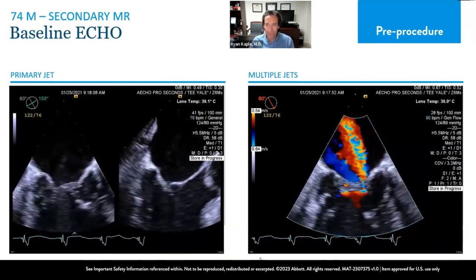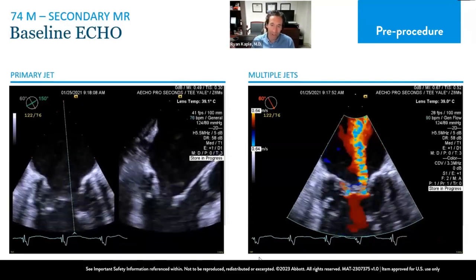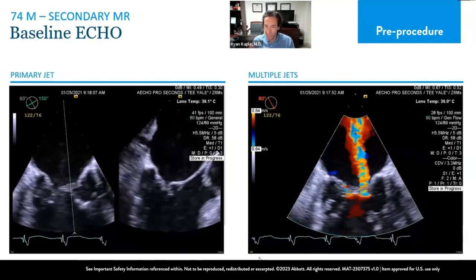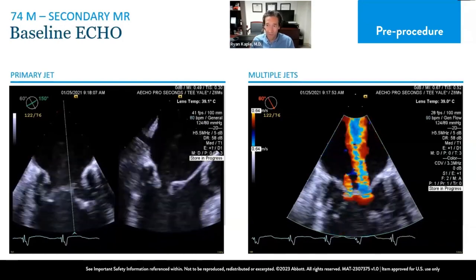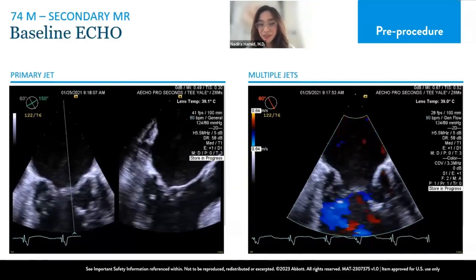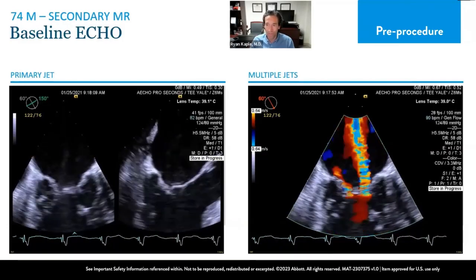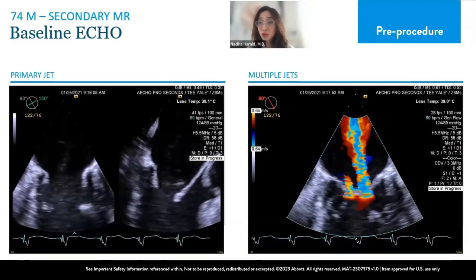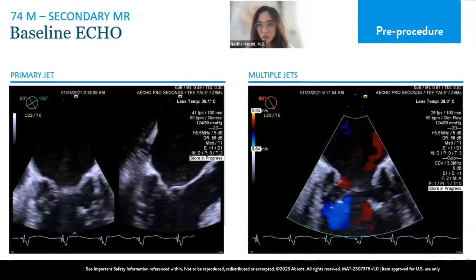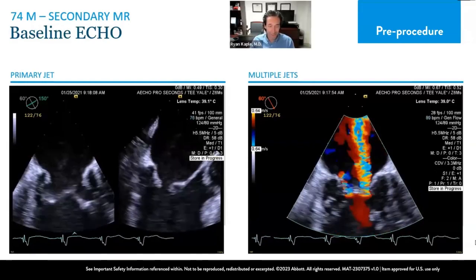But these 2 jet cases are really tough because you have to understand that potentially when you treat the more dominant jet, there's going to be an impact on that other jet, specifically if you're not lined up perfectly with the coaptation line. Is that fair to say, Nadira? Yes, and I'm actually thinking, because I had a similar case just a few weeks ago, just one right in the middle, grasp both jets and get both with one. One big one, to avoid the cords, because it's literally right next to central A2P2, and so hopefully the grasp would just grab as much and then see how it does. I like that idea, especially because I know how this case went.